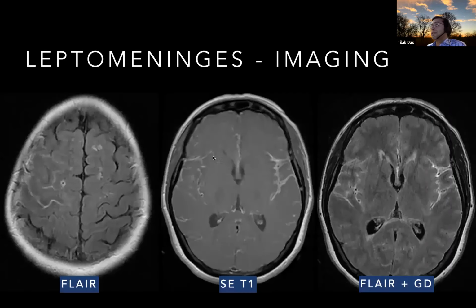So that brings us on to the last section, which is just about leptomeningeal disease. So the leptomeninges, of course, the pia, extend down to the brain surface, so you'll see it in the sulci, and the main way to differentiate it from thick dural disease is that you'll see abnormal signal within the sulcus and at the very surface, a thin line at the surface of the brain.